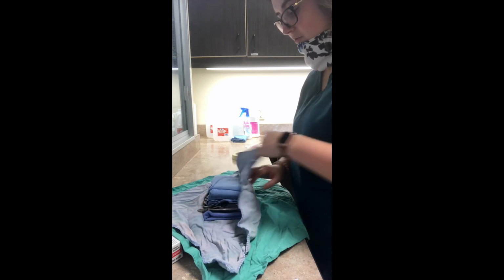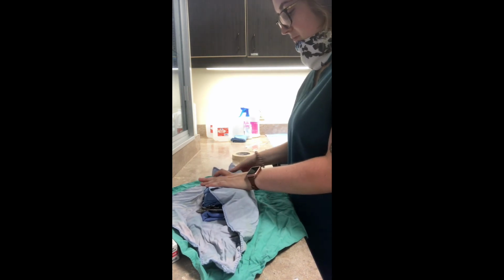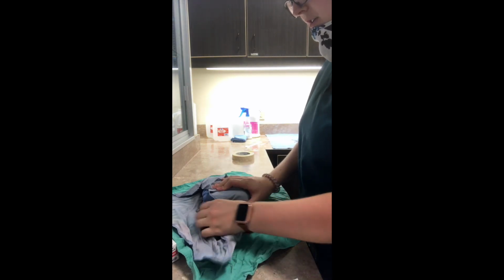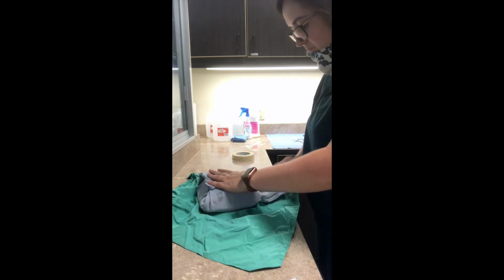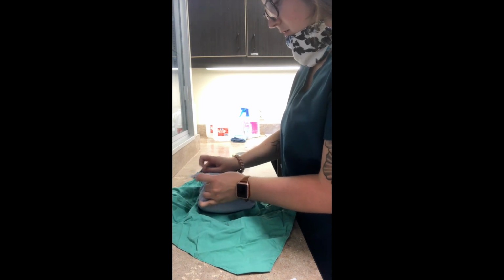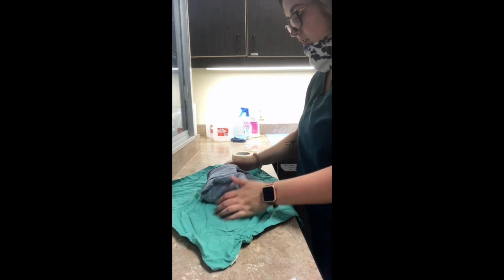So we're going to fold the first layer over, leaving a tail, then a side, leaving a tail, the next side, and tuck it in. Then for the outside, we're going to do the same thing in the opposite direction.